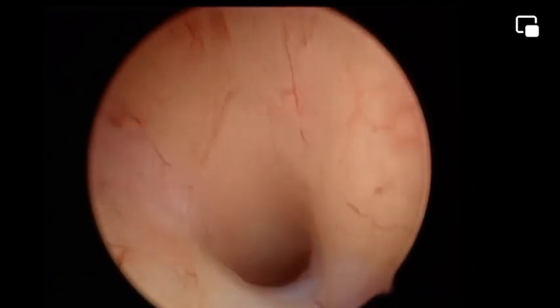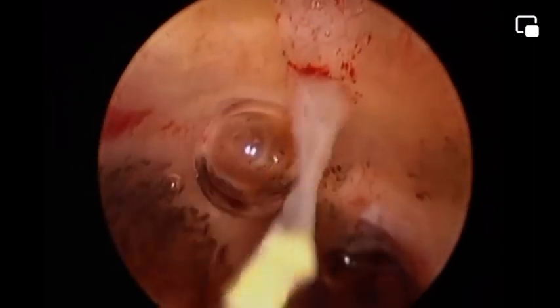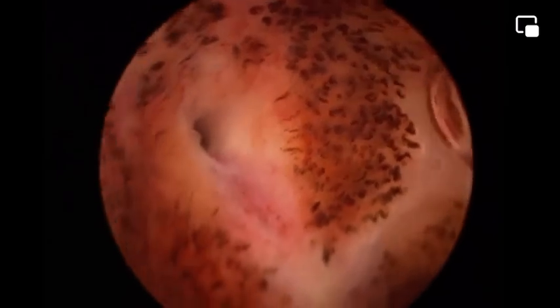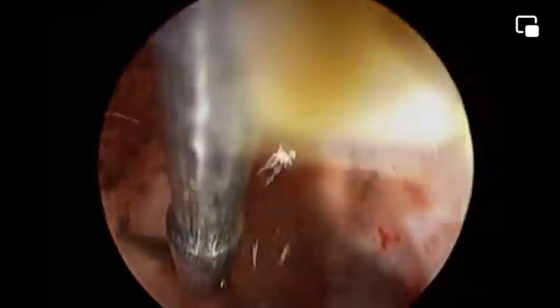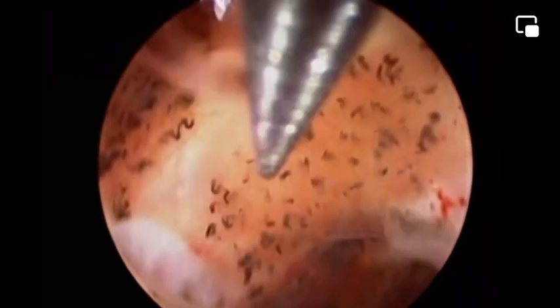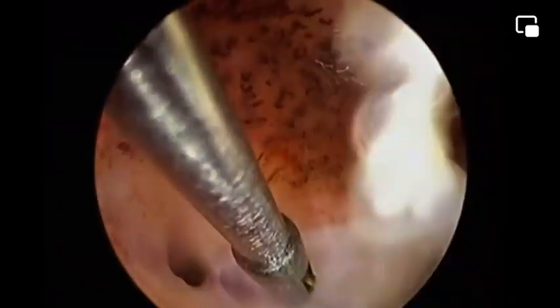Looking inside the cavity, identification of the topography is achieved by locating a landmark, which is a tubal ostium. And obviously, there are intrauterine adhesions following the cesarean section. This is a landmark, one tubal ostium, and there is a central thick band of adhesions. So, dealing with intrauterine synechiae or adhesions, there are two options: either to use the electrocautery resectoscope or the scissors, as I am doing here. Definitely, scissors are preferable because they inflict less damage to the endometrium. Electrocautery cuts and coagulates, and the thermal spread might affect the already weak, poor endometrium.